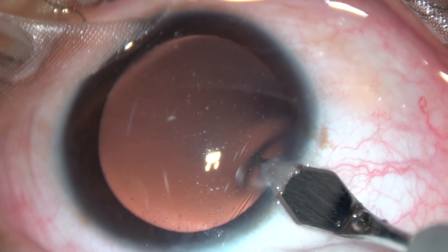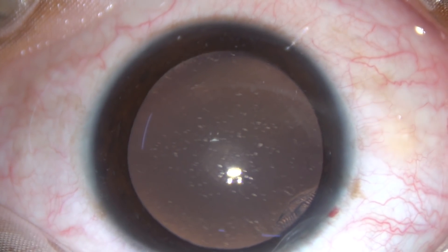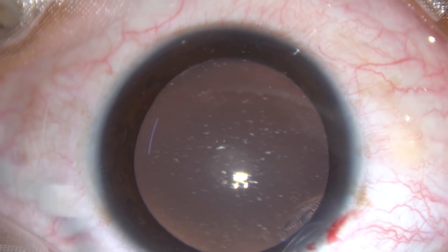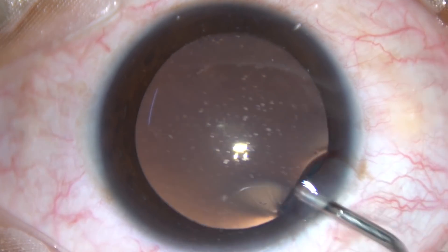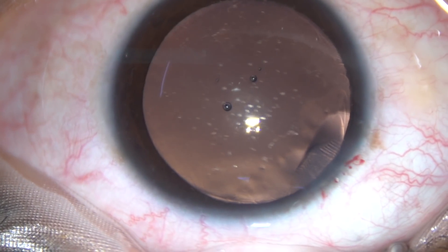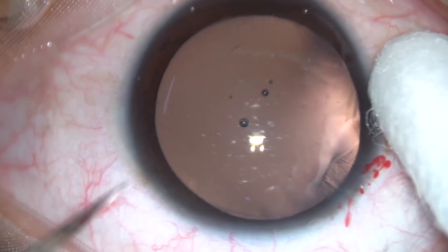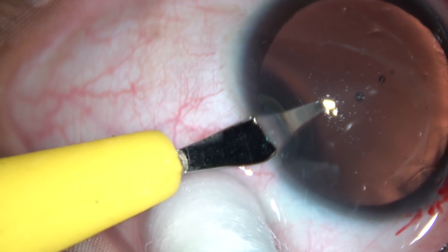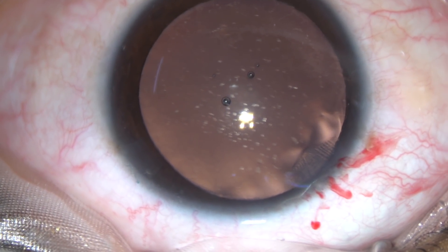This is the main entry, 2.8 mm, at a selected site. Now, 2% hydroxypropylmethylcellulose is injected into the anterior chamber. One side port is made on the left side of the main incision, about 3 clock hours away.